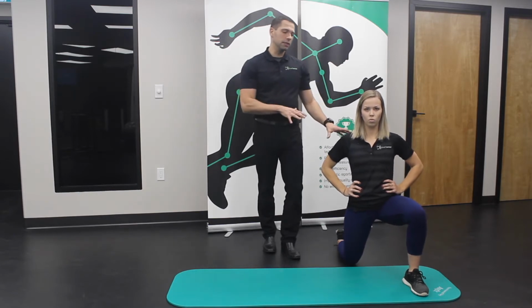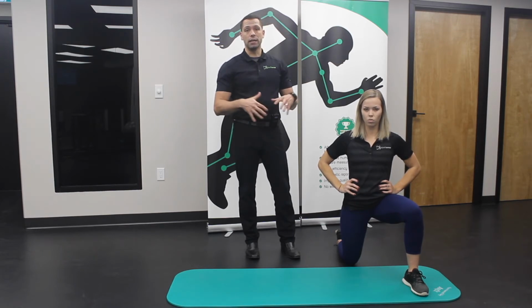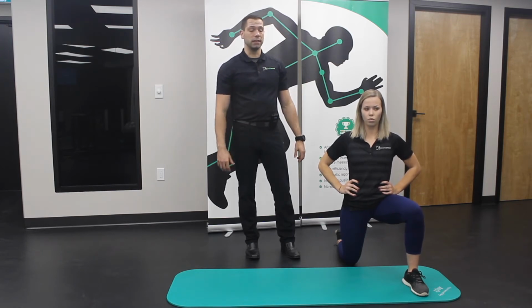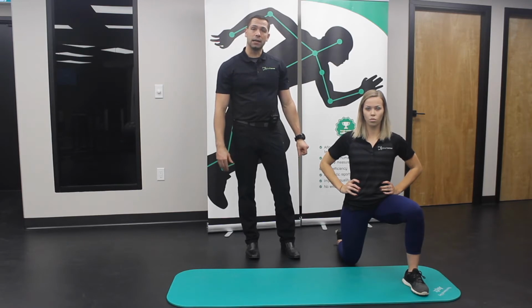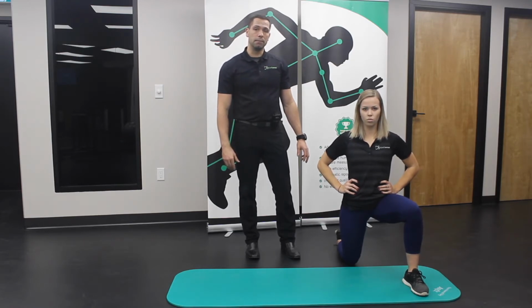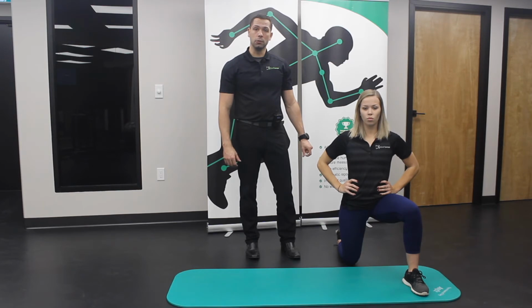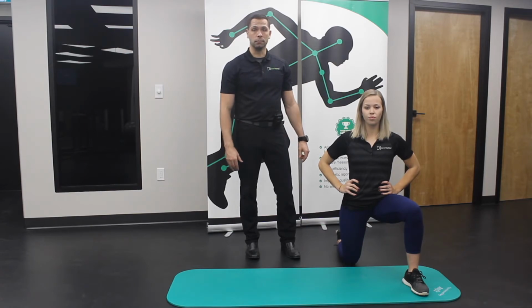It's very hard to do this visually by eyesight, so it's great to have an assessment tool that can give us information and feedback as to if there is a body tilt and how much deviation is occurring in that plane, and that's why we use Kinetisense. This hip protocol, along with the Kinetisense software, provides great insight as to the overall mobility of the hip in those planes, and if there's any regression or progression during the course of treatment.